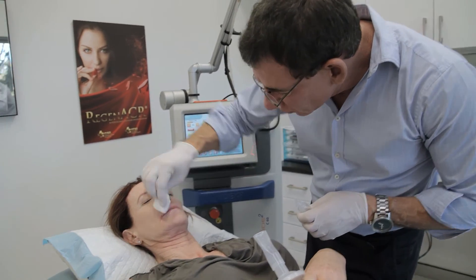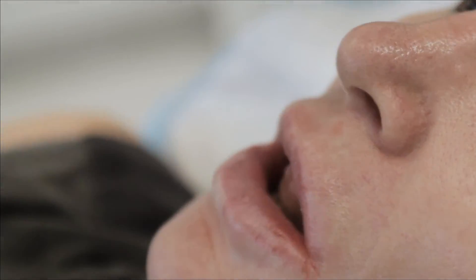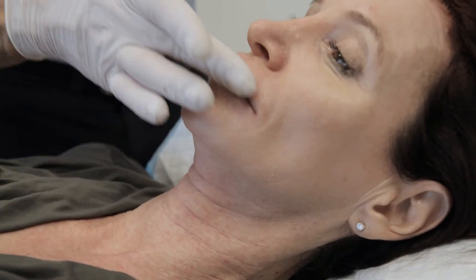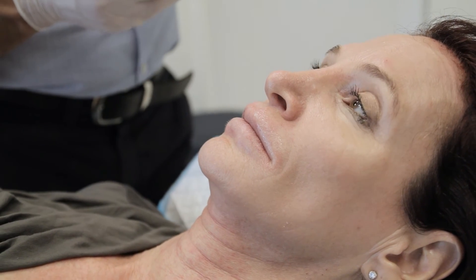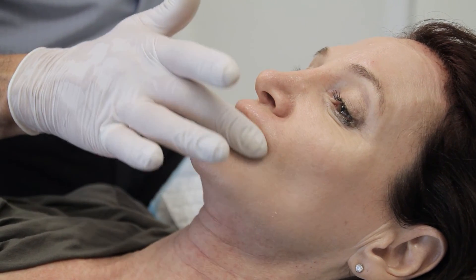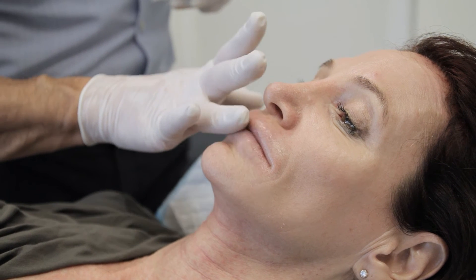I'm wiping the remaining local anesthetic off there. How sore is that? It's doable? The lips actually don't look bad, all things considered. The nice thing about this is it improves the colour and texture, gets rid of the chapping, and gives you a more youthful pinker colour that just looks better — moister. And lip appearance is a very important feature on someone's face — it signals health and freshness.